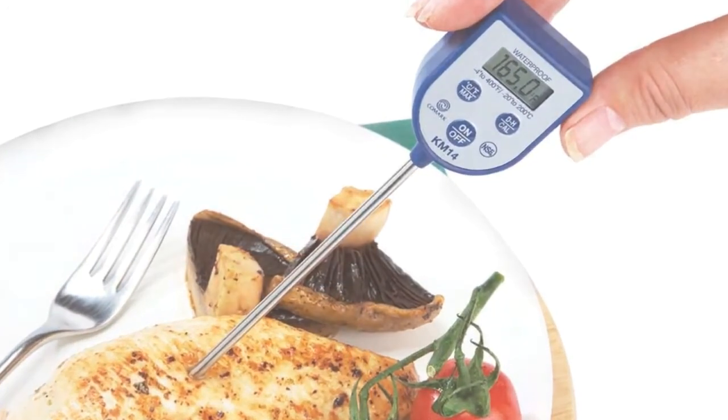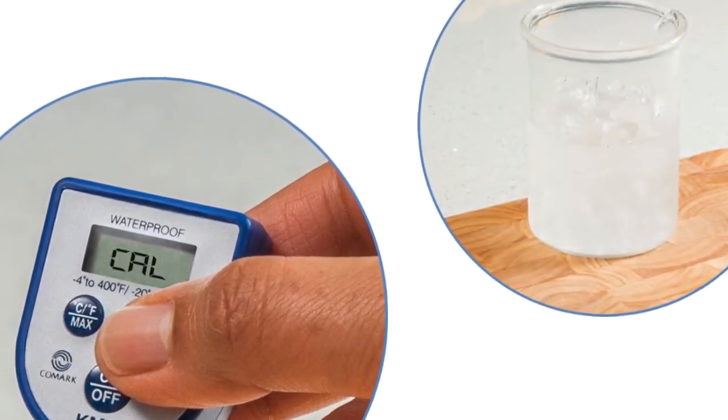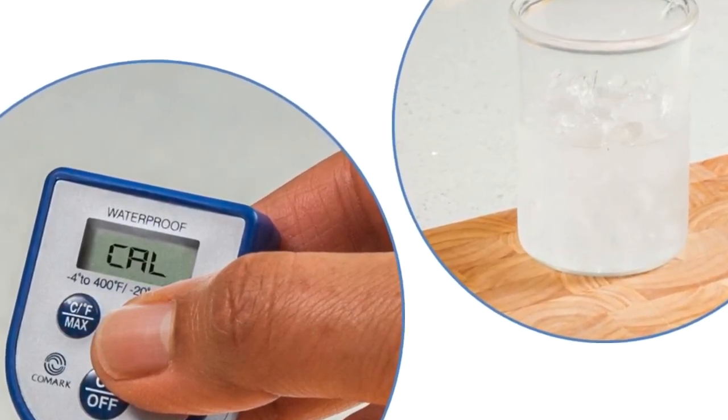It should be noted that CAL will be displayed on pocket digital thermometers any time the CAL or DH button is pressed for 8 seconds. However, the thermometer will not be recalibrated unless the probe is inserted into a crushed ice solution or water bath at 0 degrees centigrade or 32 degrees Fahrenheit.